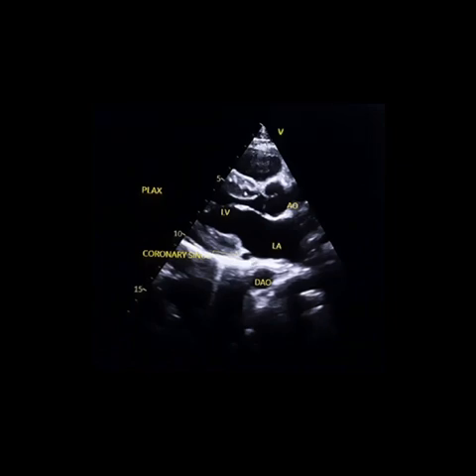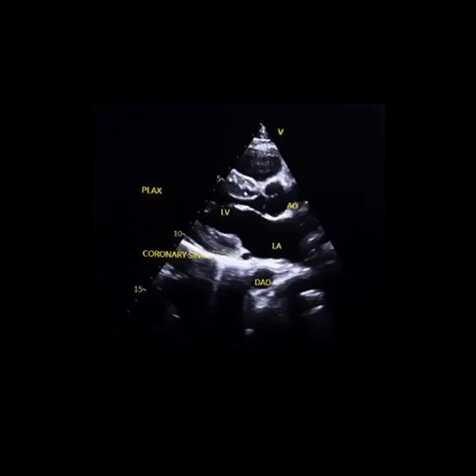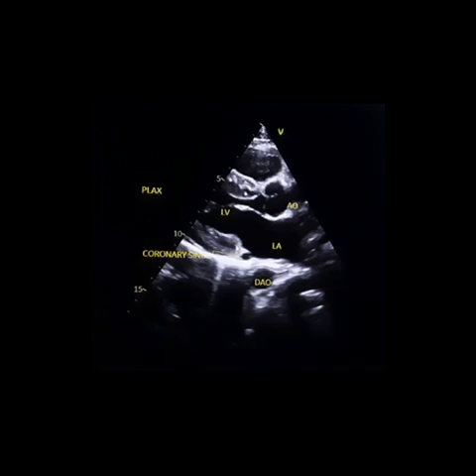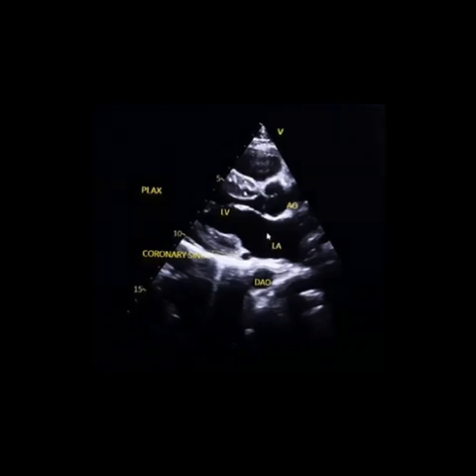So this bright white structure is the mitral annulus. This is the coronary sinus. This is the posterior leaflet of the mitral valve, and this is the left atrial cavity. Let's see how it looks in a dynamic flow.